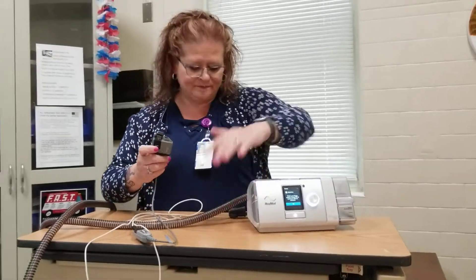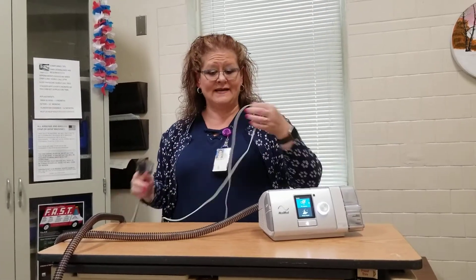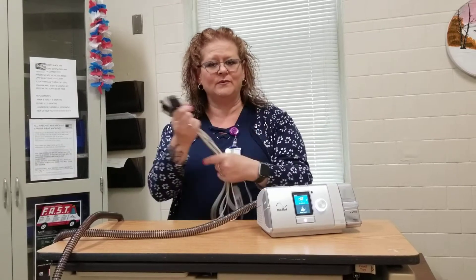And that's all there is to it. When we get the pulse oximeter back, we'll do a download online and it'll show us how well your oxygen is holding up with your CPAP machine.